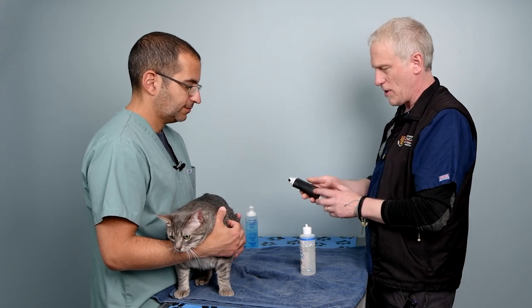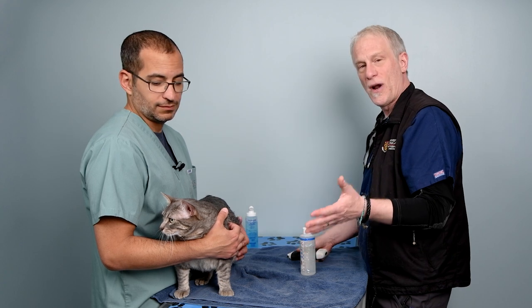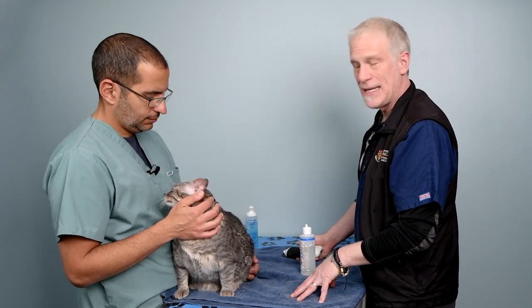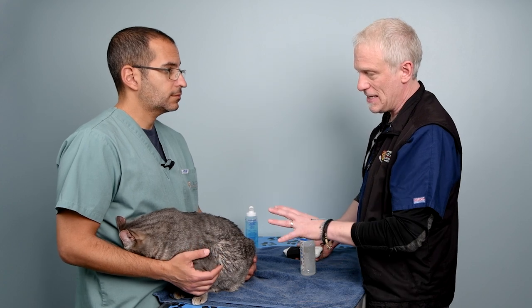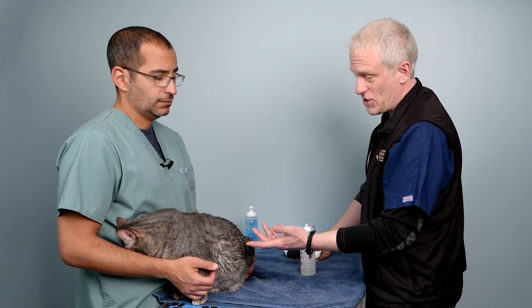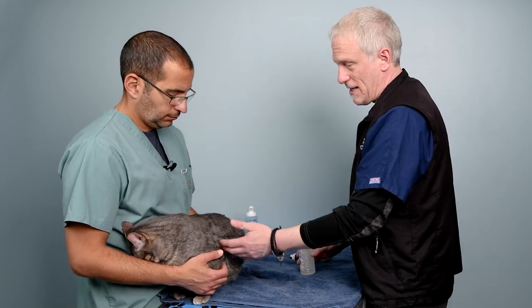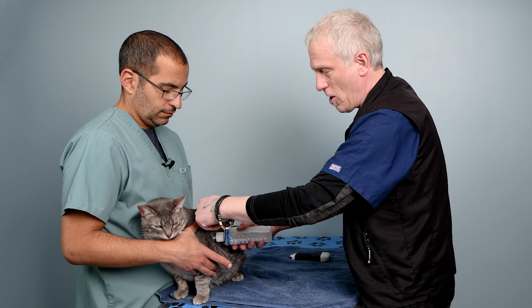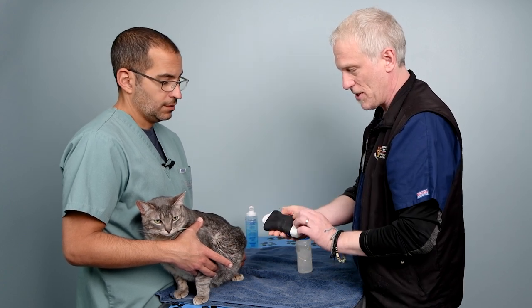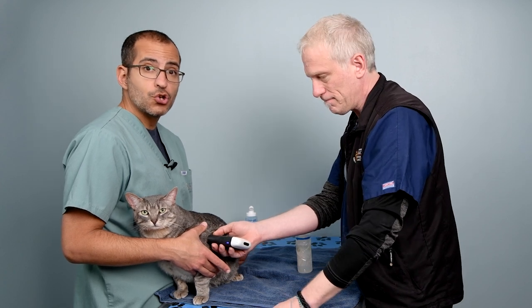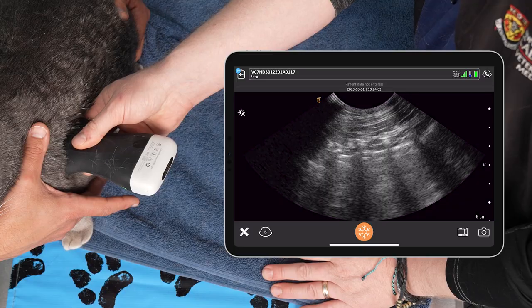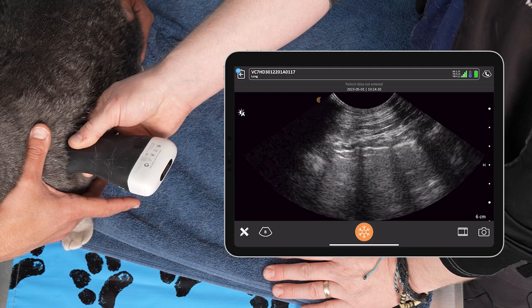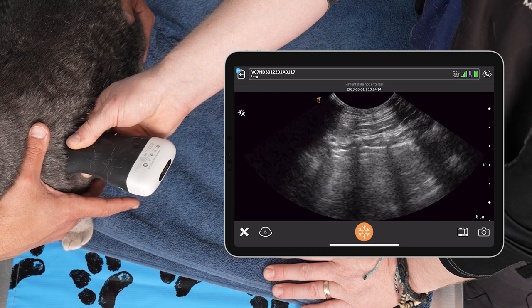When we start, we want to put the marker of the probe towards the head and set our depth to around four to six centimeters. We'll use voice command features to adjust gain and depth without having to leave the patient. Starting at that cranial border — palpating the front limb, separating the fur, applying a little alcohol, about halfway up the chest — we place the marker towards the head to ensure we're over lung. Unfreezing the image, we can see the soft tissues of the thoracic wall, the ribs and rib shadows, and then a bright white line — the bat sign — that's our pleural line.